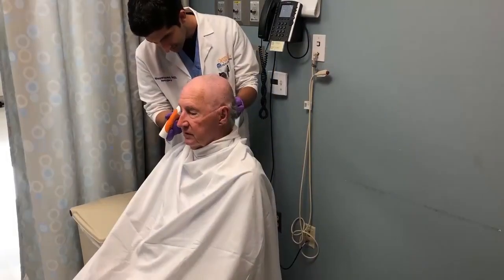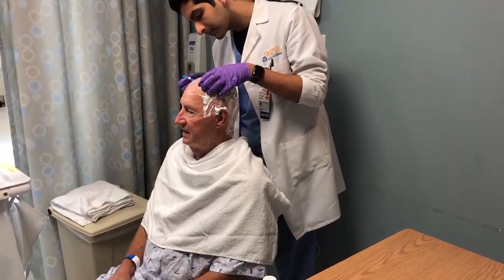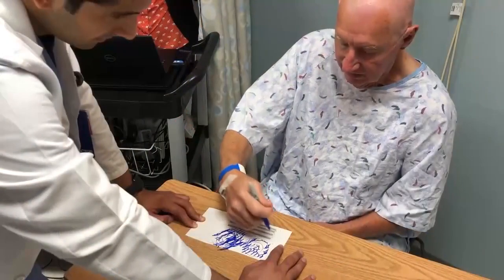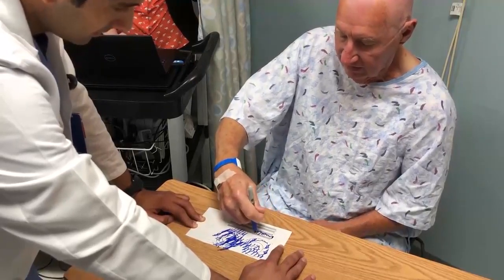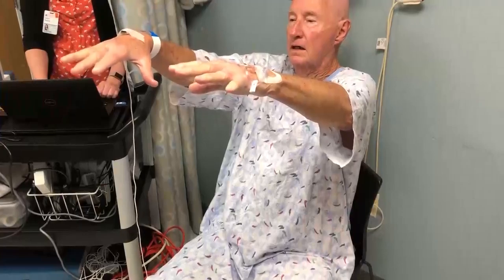The patient must first undergo a full head shave. This is necessary in order to prevent the formation of microbubbles and subsequent scalp burns. Baseline tests are then performed, which include kinetic and postural tasks. For more objective measurements of tremor, an MRI-safe accelerometer can be attached to the hand that will be treated.